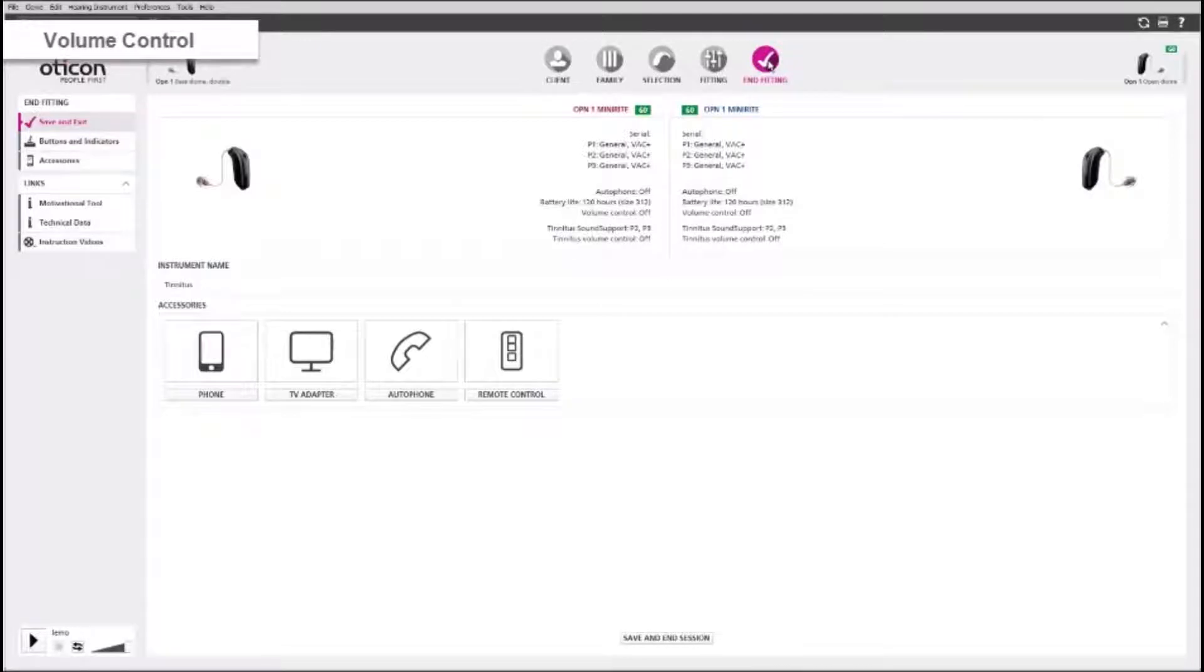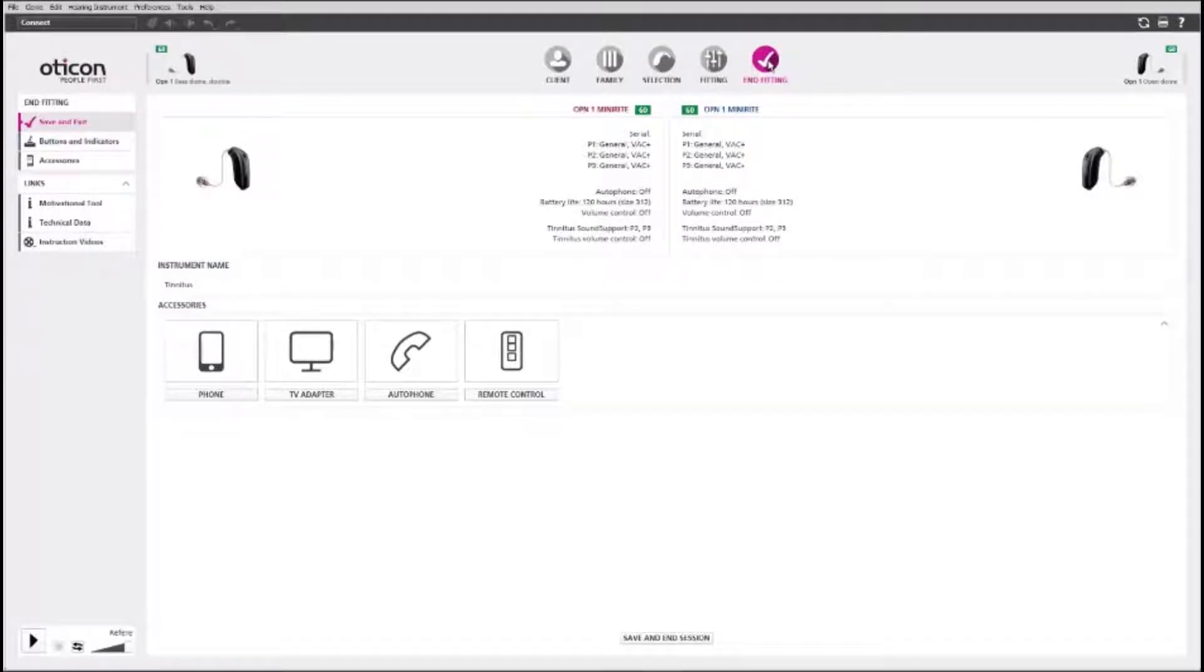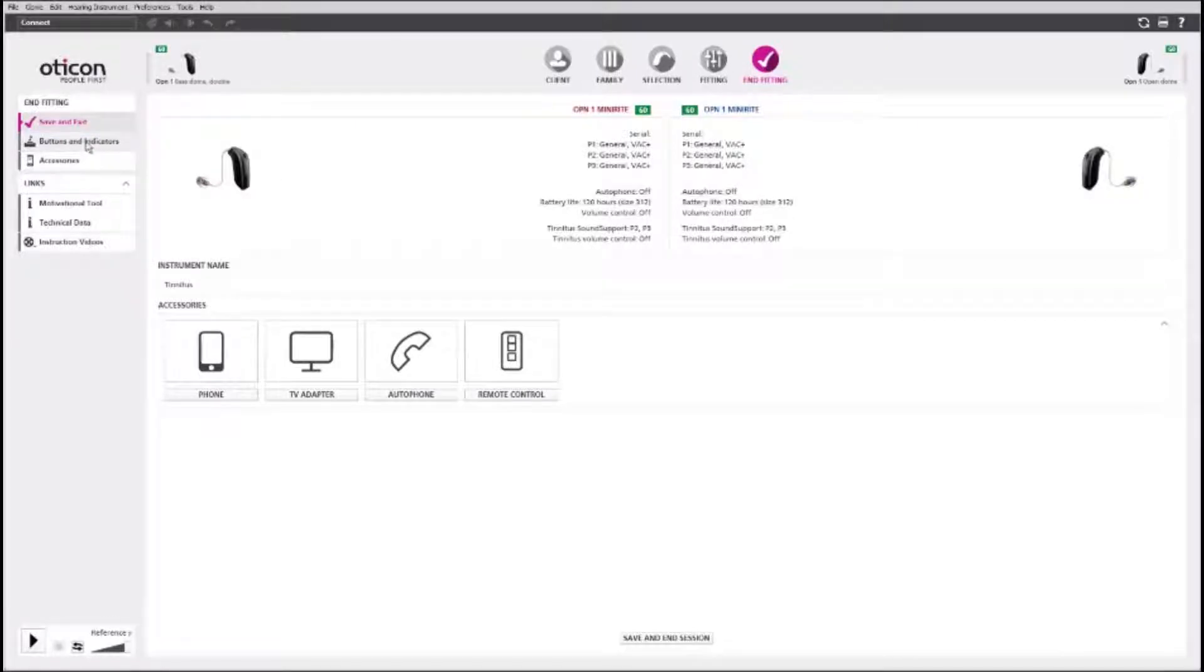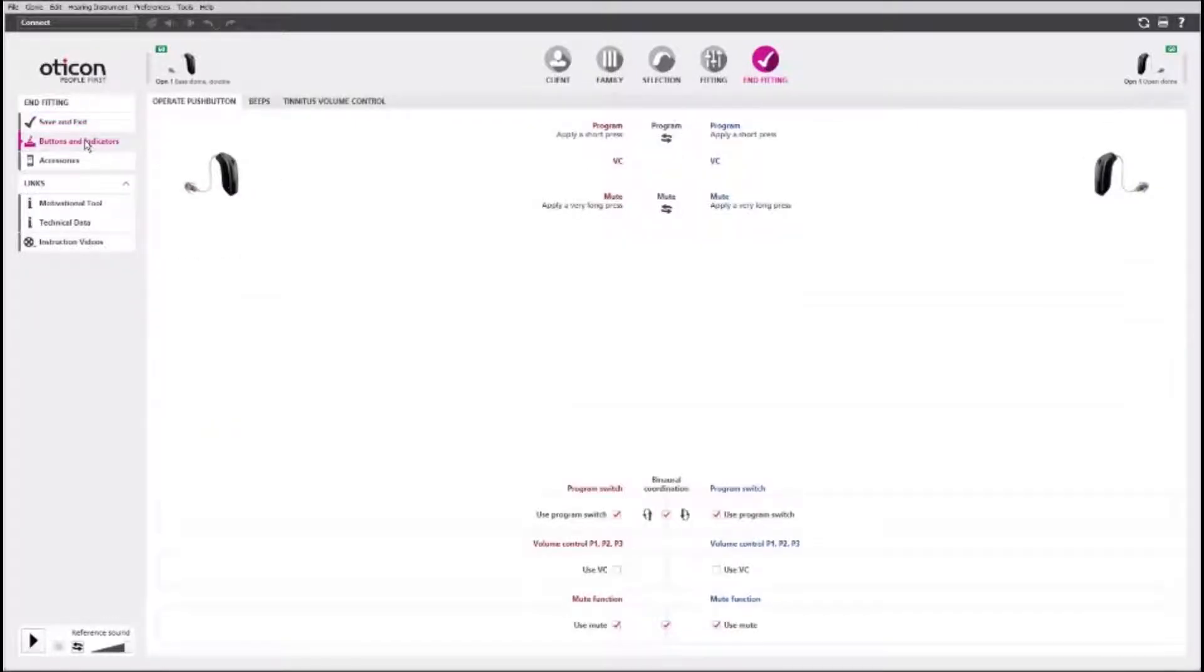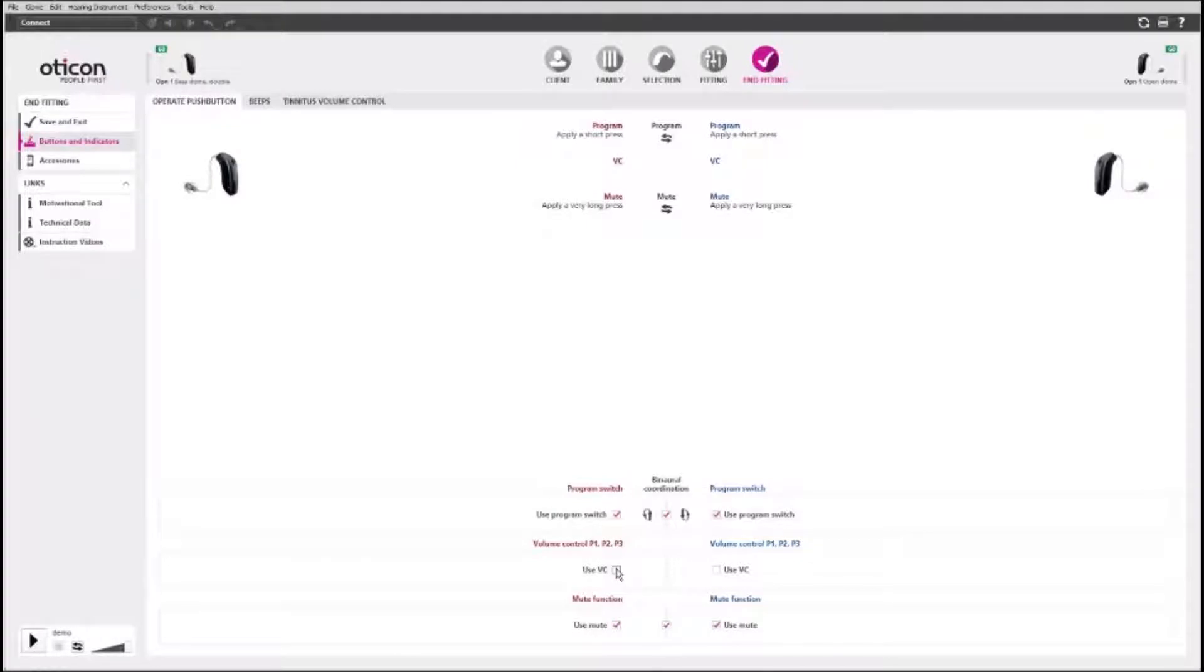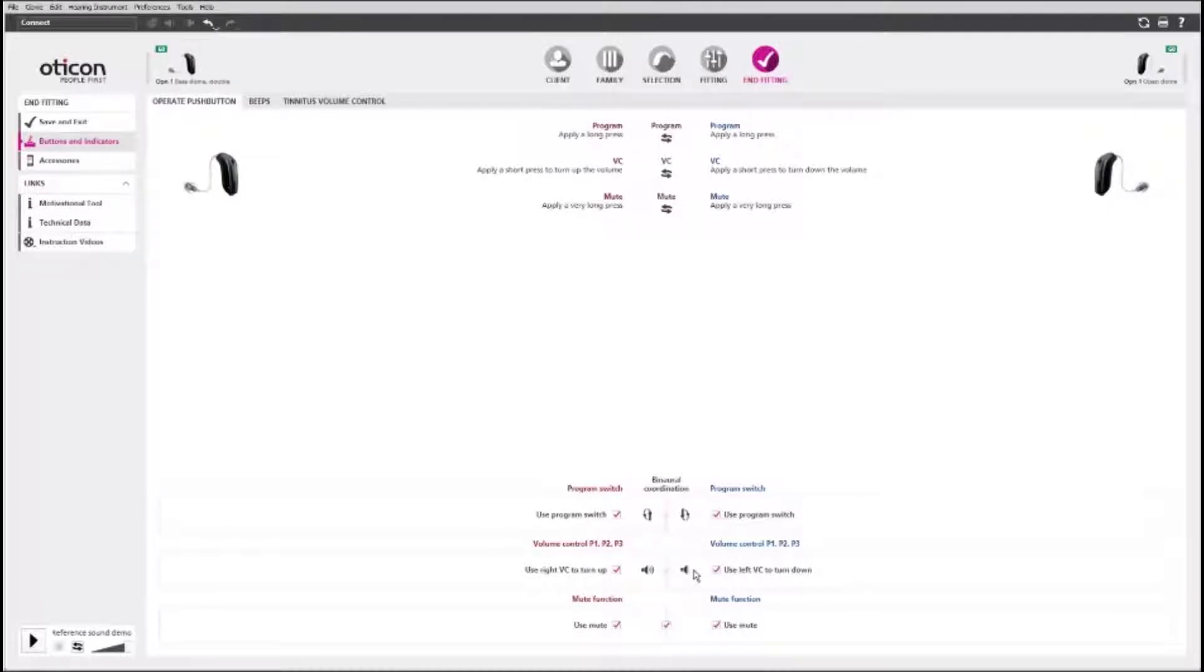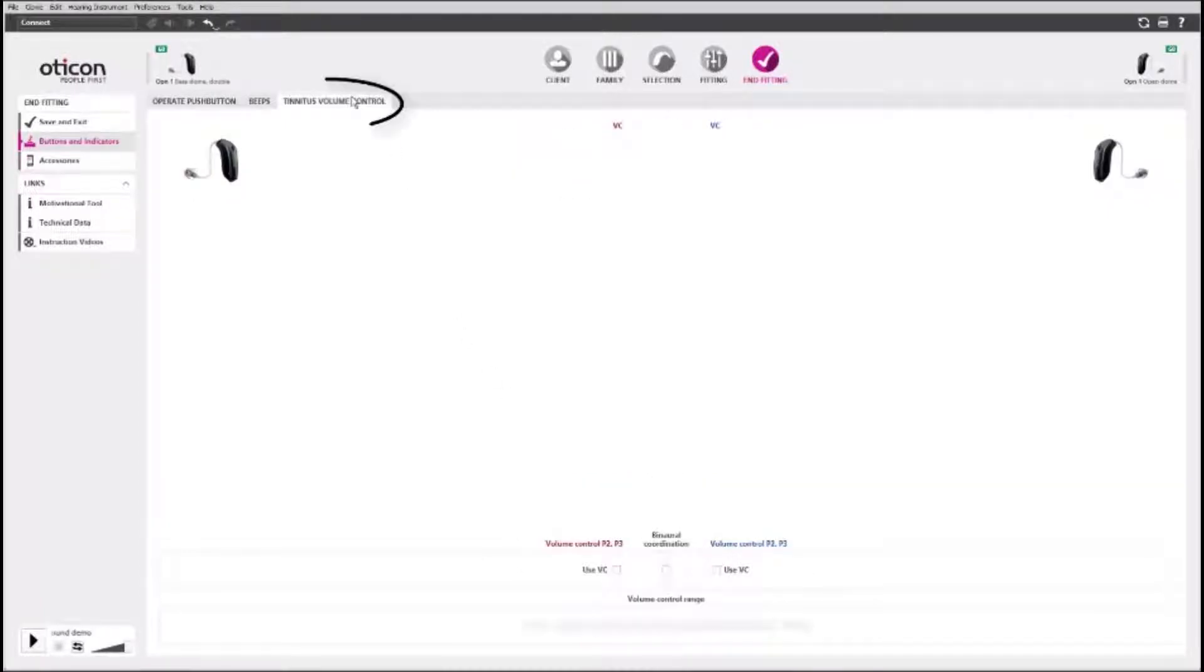You can configure the push buttons to operate as a volume control for the tinnitus sound support relief sounds. On the end fitting screen, select buttons and indicators. If you have a program on the hearing aids with amplification only, the volume control will just regulate the gain. If you wish to configure the push buttons for the tinnitus programs, go to the tinnitus volume control tab.